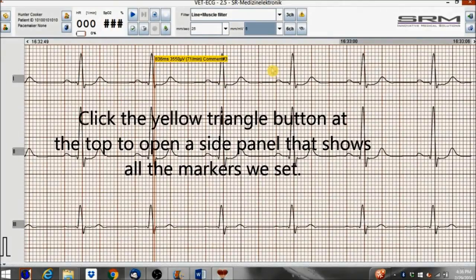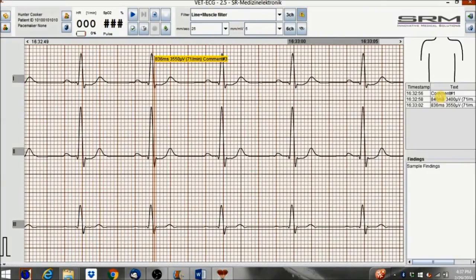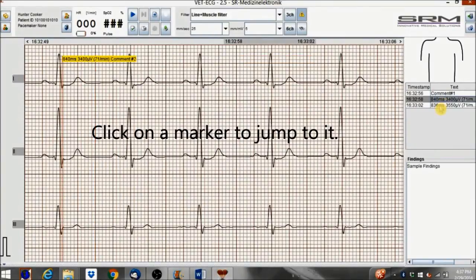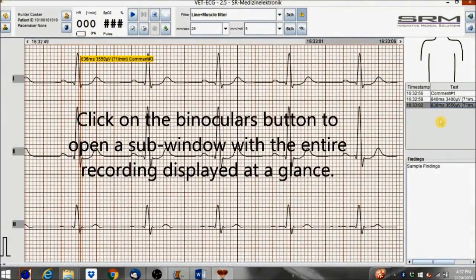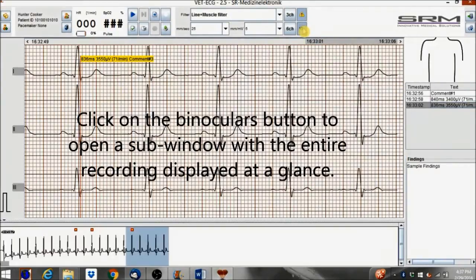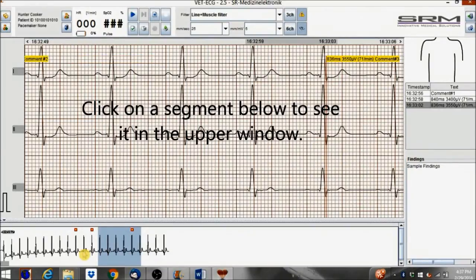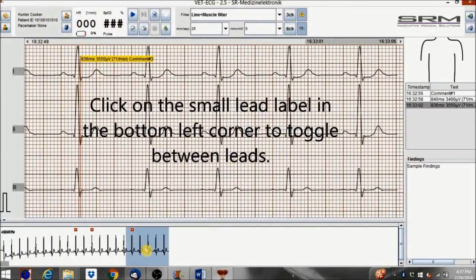Click the yellow triangle button at the top to open a side panel that shows all the markers we set. Click on a marker to jump to it. Click the binoculars button to open a sub-window with the entire recording displayed at a glance. Click on a segment below to see it in the upper window. Click on the small lead label in the bottom left corner to toggle between leads.